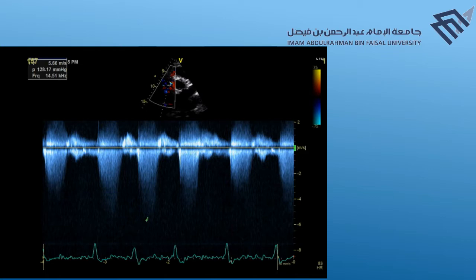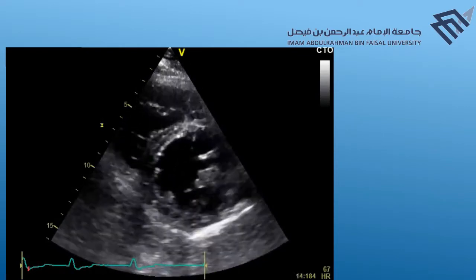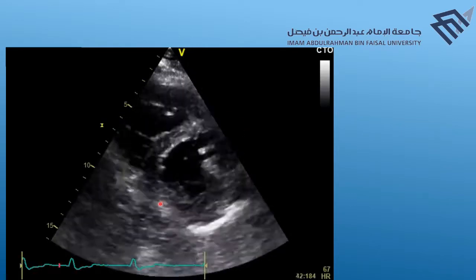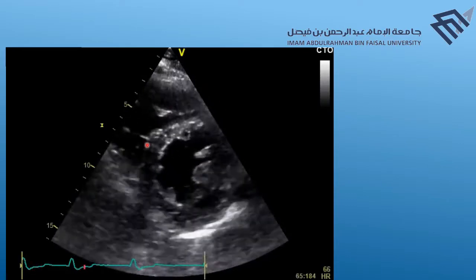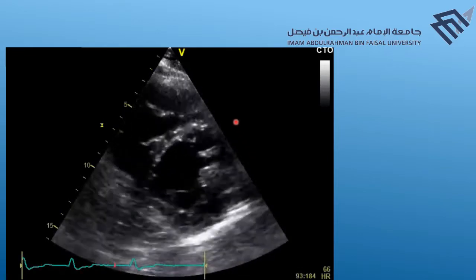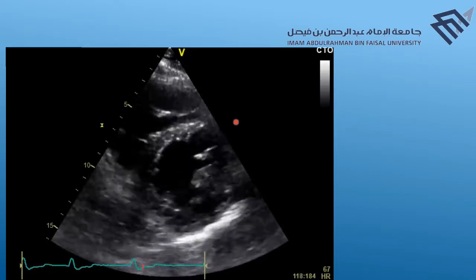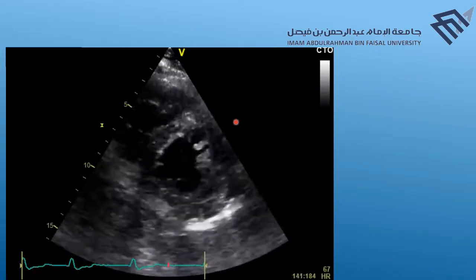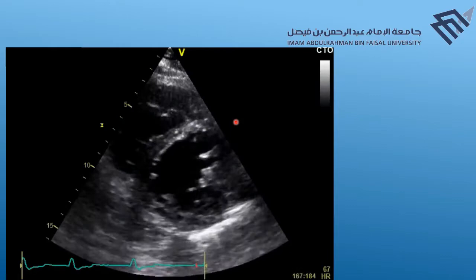This is a left parasternal short axis view. It's almost at the level of the mid-ventricle, a little bit basal. We can see a papillary muscle here. However, part of the mitral valve is shown here. What we note here is that the flat septum is only during diastole. However, the LV appears perfectly circular during systole. So it goes with RV volume overload instead of pressure overload. So this should ring a bell, and it does not go along with our finding of a pressure of 128 across the tricuspid valve. Just keep it in mind and let's see the coming slides.